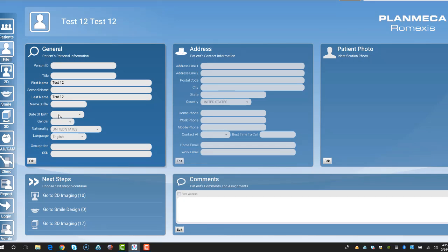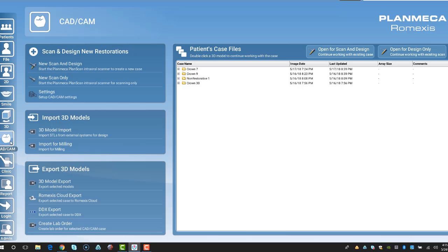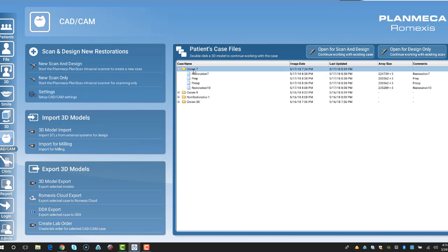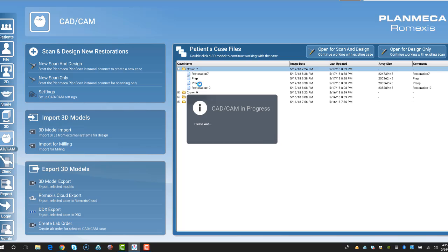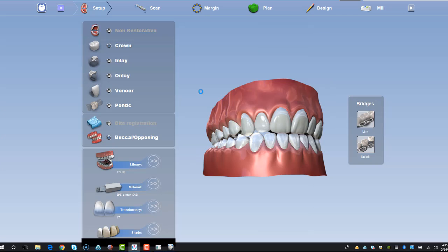Then we can go ahead and open up another case, hit CAD CAM. We're going to go ahead and choose tooth number seven to open up in the setup page so I can show you how to deselect a tooth if you accidentally chose the wrong tooth.